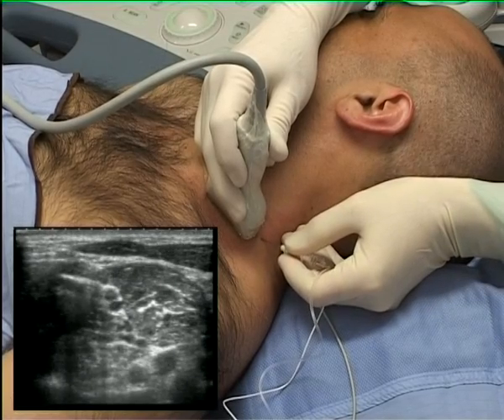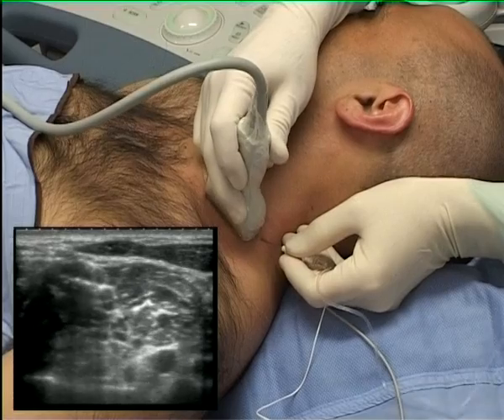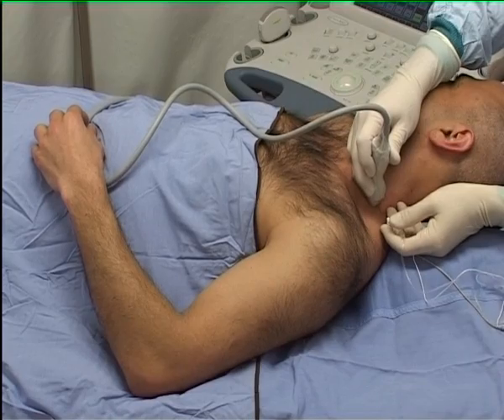A nerve stimulator has been connected here for demonstration purposes only. Note how the needle tip needs to be repositioned even once within the groove in order to generate a muscle response.